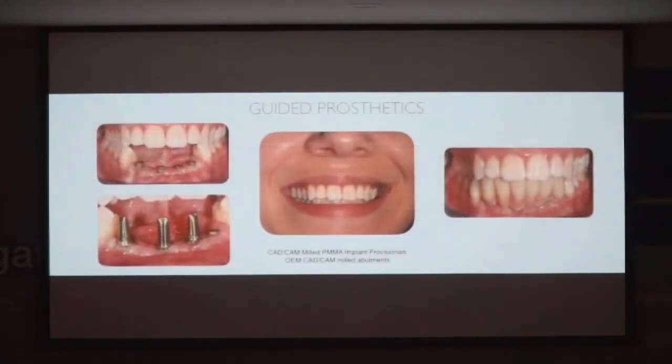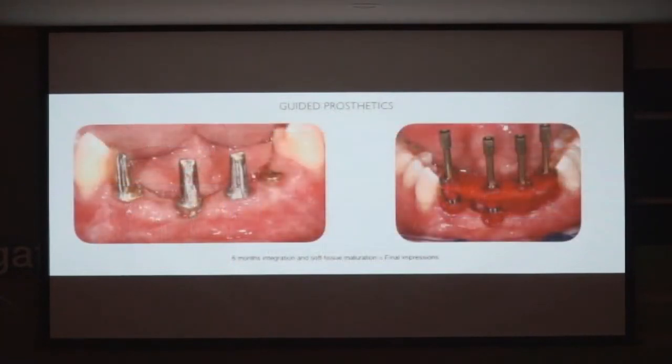So these are the temporary cylinders that were milled. And later I'm going to do a little soft tissue graft there. And that was allowed to mature. And then he's taking impressions now of the mature tissue. And you can see he's using that technique I showed you before with running the Duralon into the soft tissue to capture the profiles that he's developed with the temps.